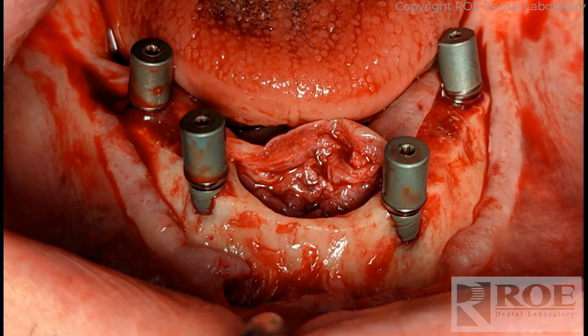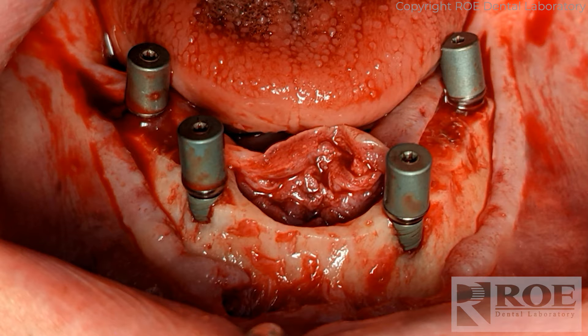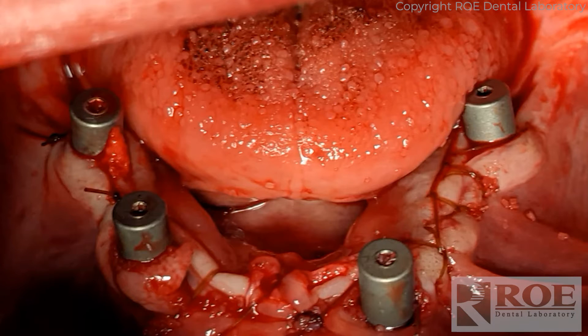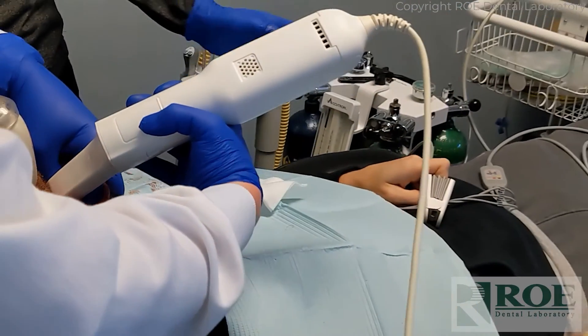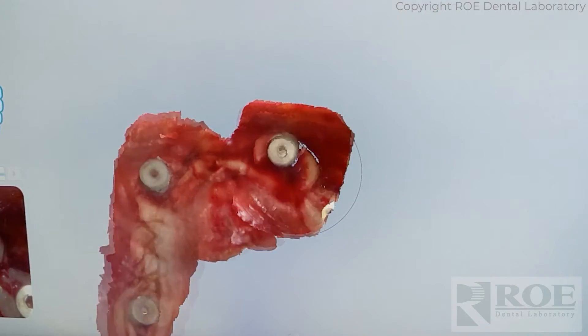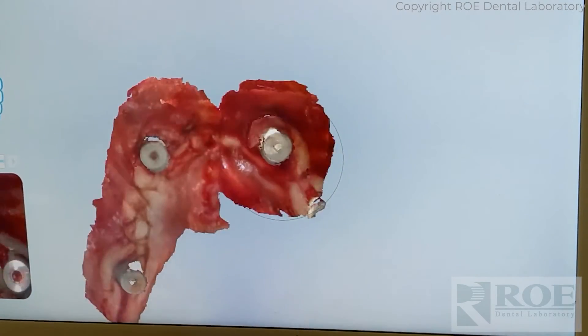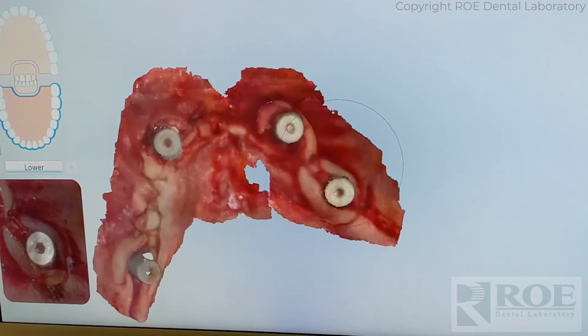The scan refs are placed in after that initial scan. We go from the scan bodies — scan those, remove them, then scan refs are placed in the mouth. In this case, the doctor also did a little bit of bone grafting. While those scan refs are in the mouth, the doctor sutures around them. These are pretty normal scan bodies. The doctor then completes a digital impression of the scan bodies, which can be a tricky scan. A lot of scanners really struggle with soft tissue, especially when it's wet and bloody, and there are shiny objects too. The doctor roughed up the surface of the scan bodies to make them more scannable, then scanned the full arch.